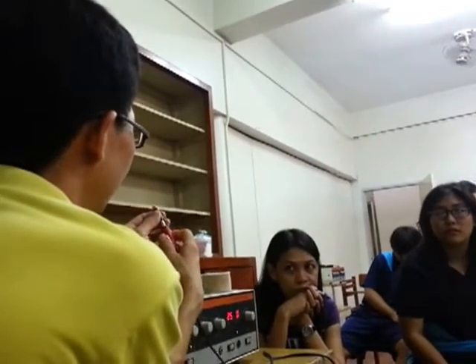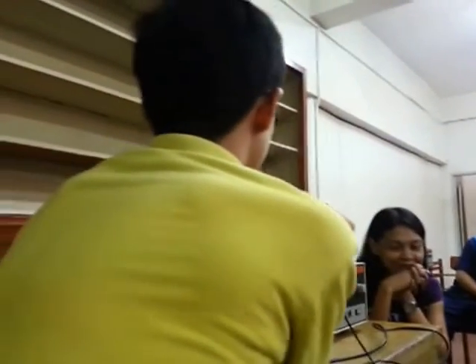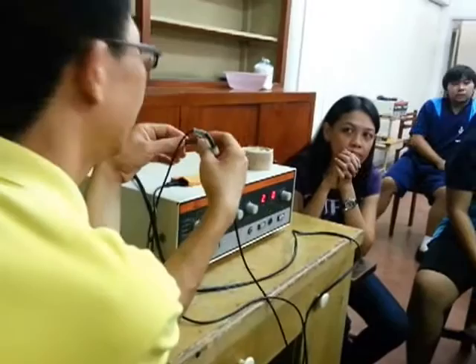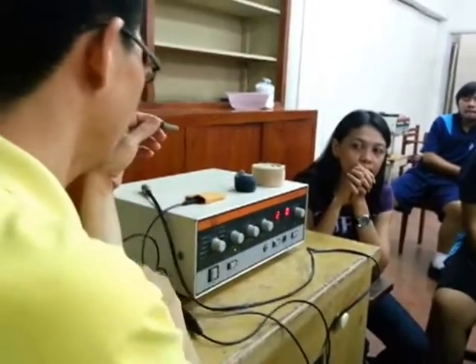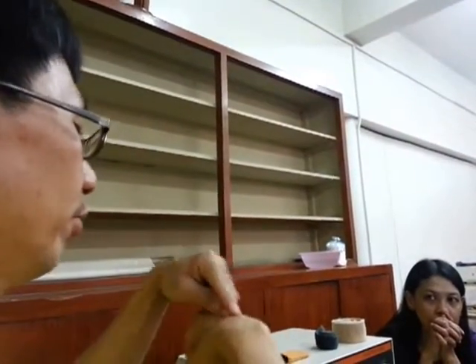So what we just do is remove this one and apply that one to the point. So you have several types of electrodes. There are still others, like the ECG type of electrode, and the roller electrode, which rolls over the area.